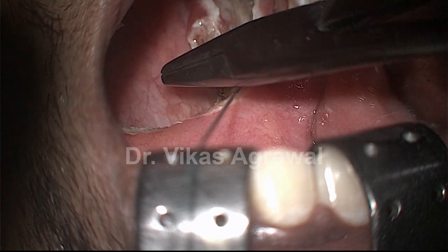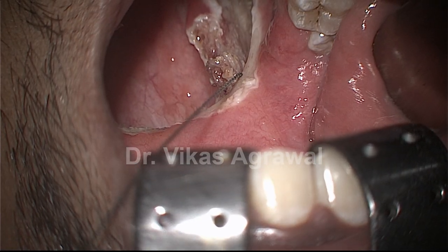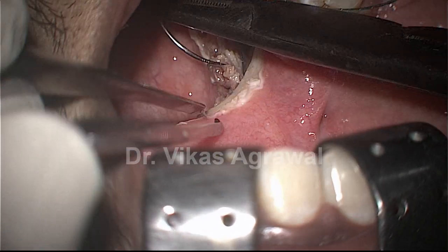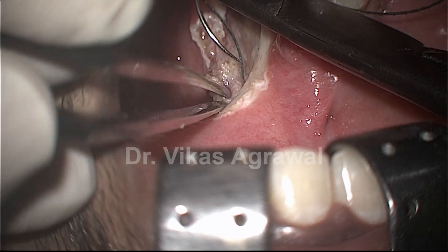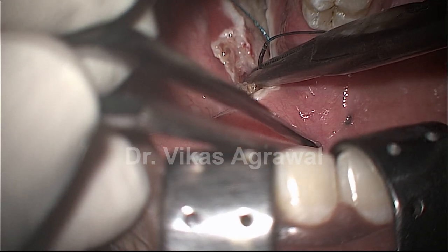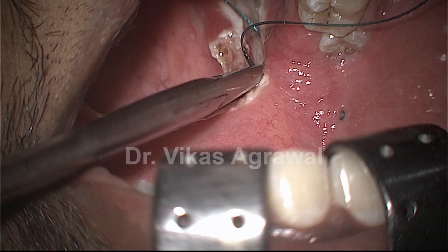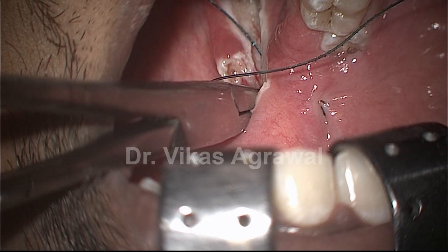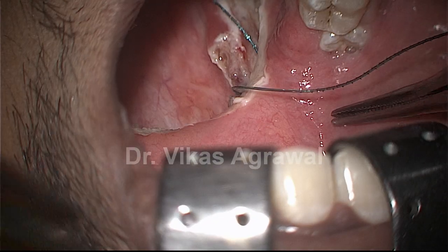See what is important — this area may be raw, but the bottleneck area here has no raw area. The whole mucosa is preserved in that area. And from there we will come back to our area of pterygomandibular raphe.